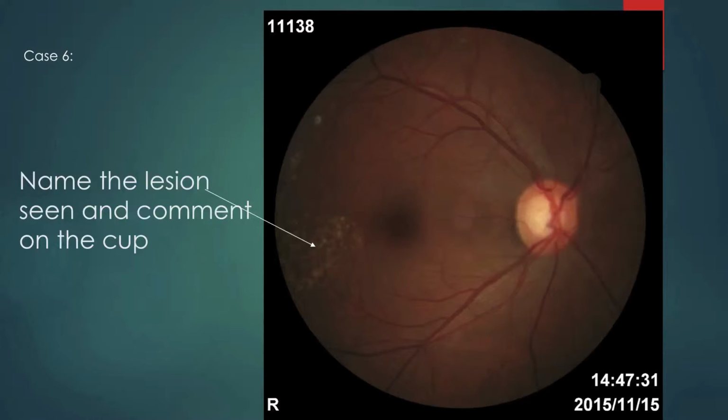Always refer if you have any doubt, because these images will be reviewed and they can be called and told not to come if there's a problem. Case 7.